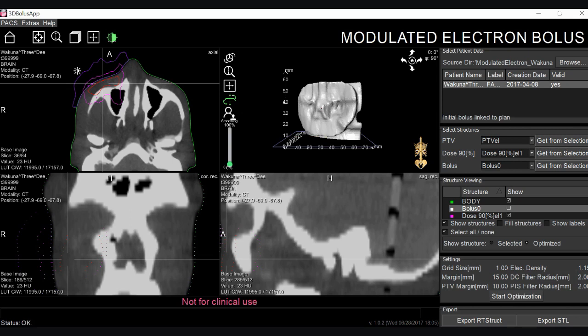The prescription isodose line remains the same as the initial dose calculation. We allow our software to communicate with the treatment planning system by exporting the new bolus structure as a DICOM image to be re-imported into the TPS for recalculation of the dose. Once the user is satisfied with the new dose calculation, the structure can be exported as an STL for 3D printing.